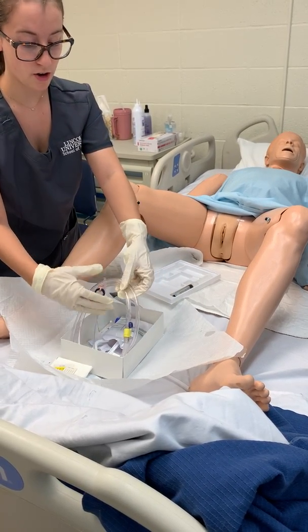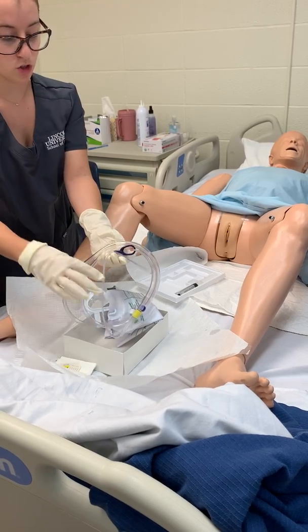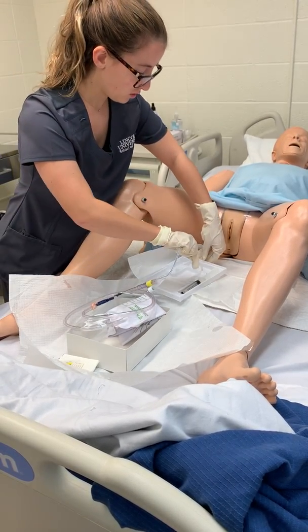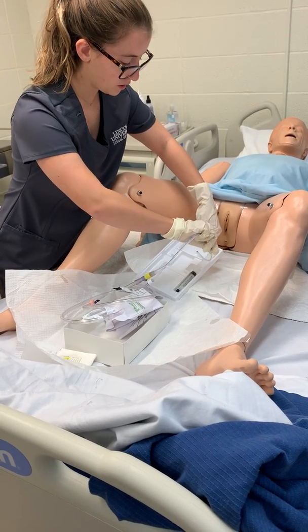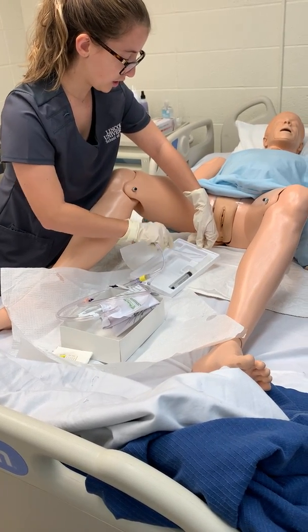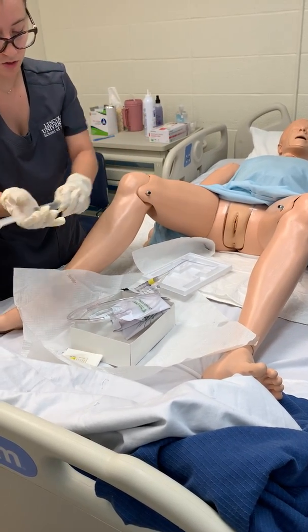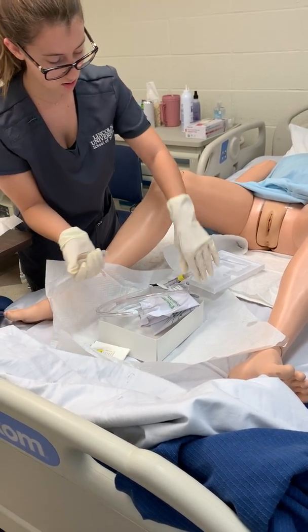And before cleaning the area, I'm going to go ahead and lubricate 2 inches of the catheter tube. And I have some lube in here in my tray already. And I'm going to go ahead and apply my syringe so it's all ready.